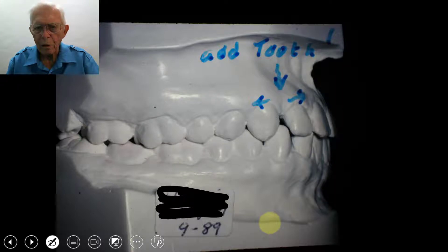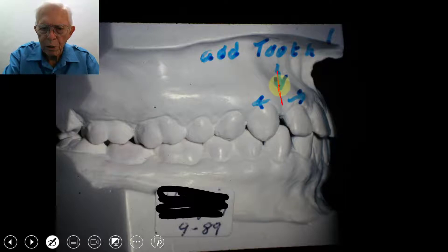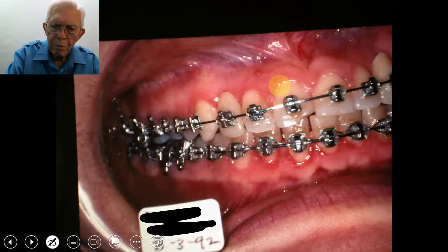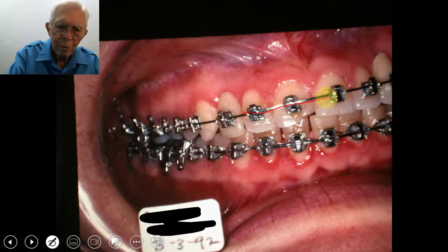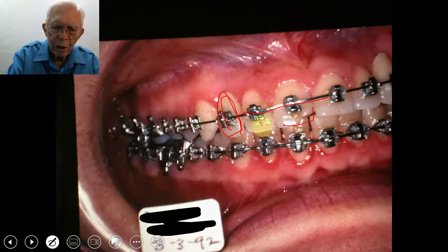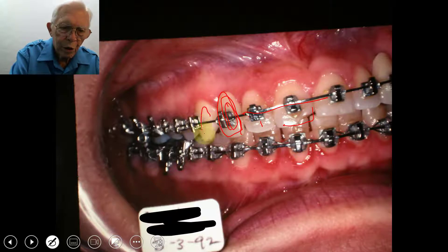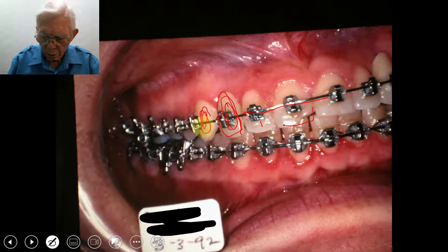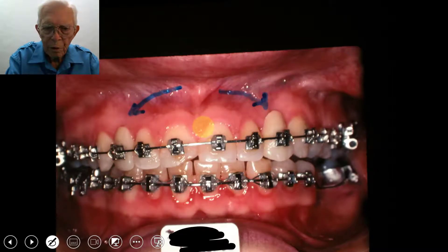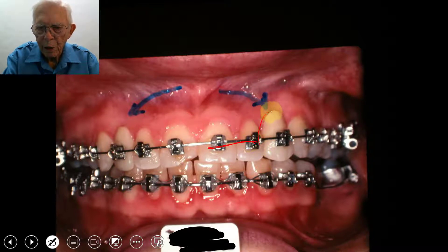We're going to put a tooth in this space here. I think she's got a little jaw joint problem. So we push these together and open that space up. This is the false tooth that we put in there — the central, which we have to reach around the lateral. This is a false tooth at the cuspid back in this area, and we did virtually the same thing on the other side of the mouth. We put the lateral and the central together, and put a large false tooth in this space and pushed this one back.